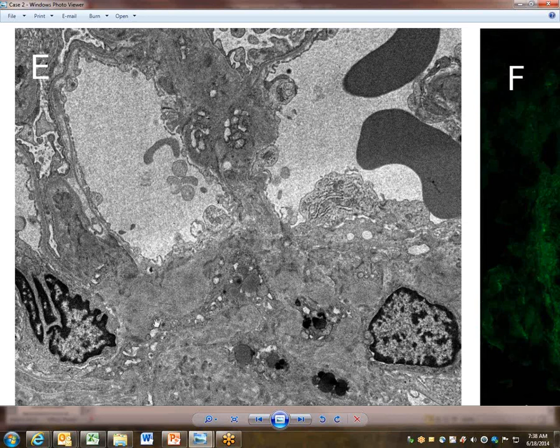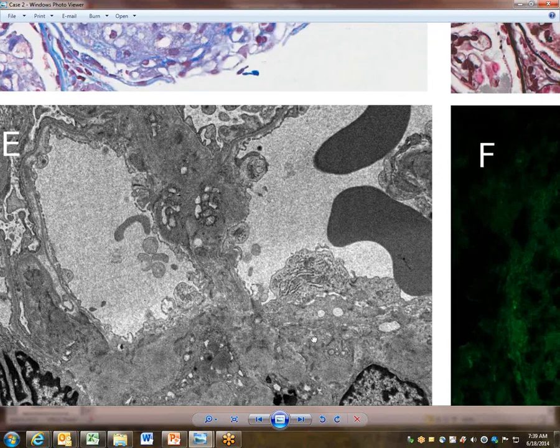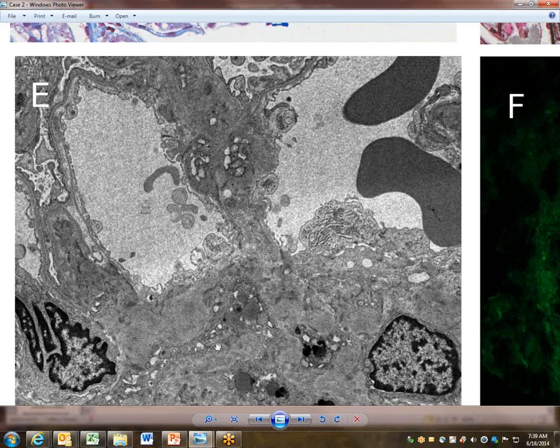And then down at the bottom 30% of the image, we have some cells where I can't quite make out cell borders, but the cytoplasm seems to contain some heterogeneous content. You've got a couple maybe membrane-bound vesicles or lysosome-like structures, perhaps, and then some have heterogeneous content, some very electron-dense material, and then others are a little more homogeneous. But again, I wasn't sure. I suppose this is what was picking up some of that silver stain, this heterogeneous content. But yeah, I think that's all I had about that.